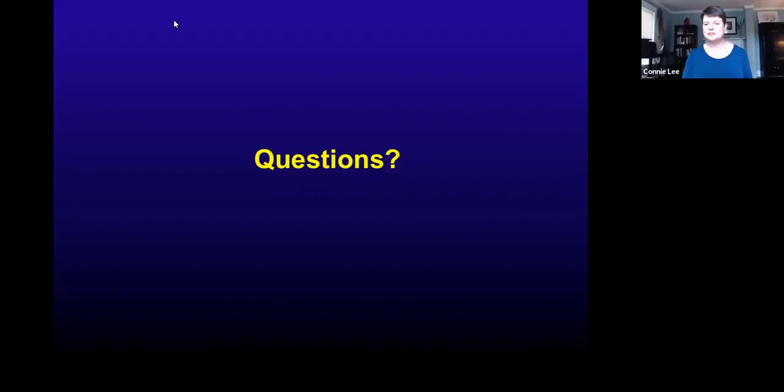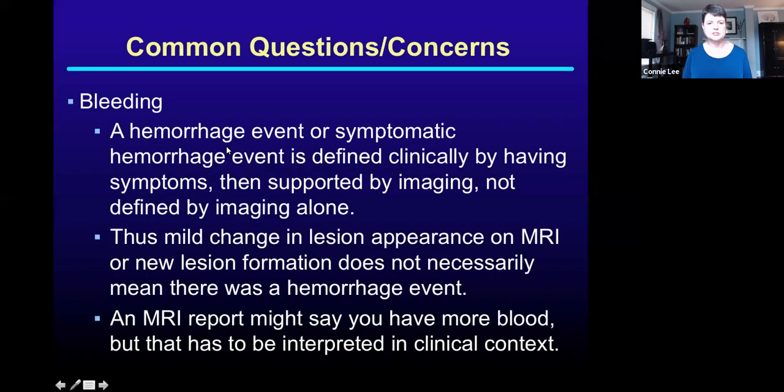And then the last question I think I have for you, and those of you who asked some questions that we didn't get to, we'll try and get back to you later. I'm looking at them and trying to judge whether this is the right venue for them to be asked. The last question here is, what does it mean when someone says chronic hemorrhage on the MRI? What do you know that this lesion shows evidence of chronic hemorrhage, or if they're told that by their physician?